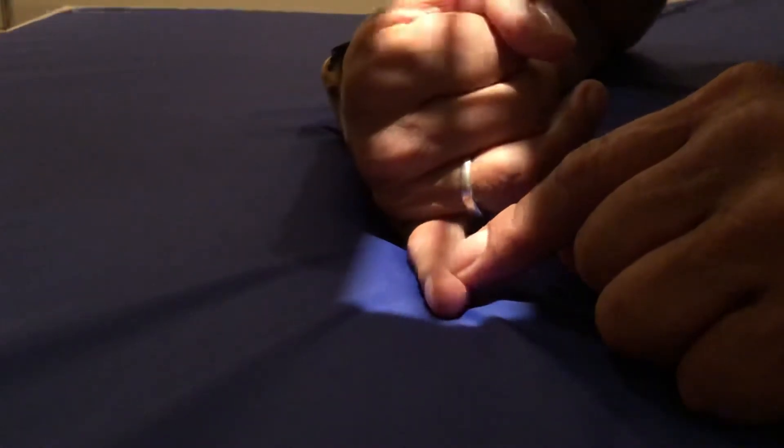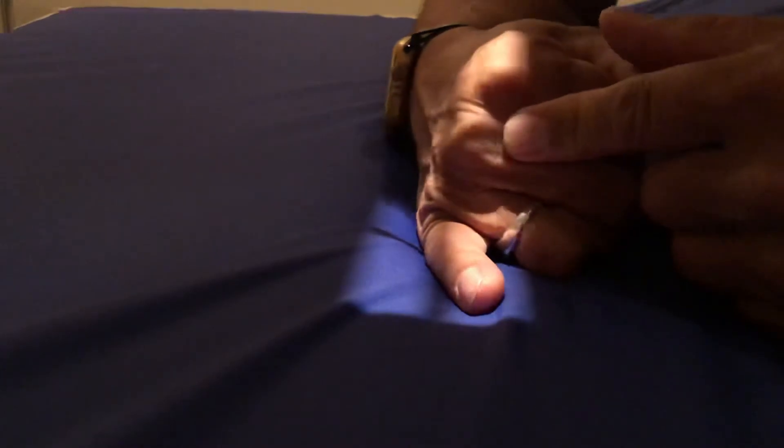If you're looking for a fracture down at the base of the finger, what you need to do is roll the hand forward a little bit this way, or a little bit that way. The reason why you're doing that is because you're getting all of these other joints out of the way. The second is on top of the third, is on top of the fourth, is on top of the fifth, and so it's really a mess to figure out. So if you can roll the patient forward a little bit just to get these other joints out of the way, or roll it this way a little bit to get the joints out of the way, and you should be okay.